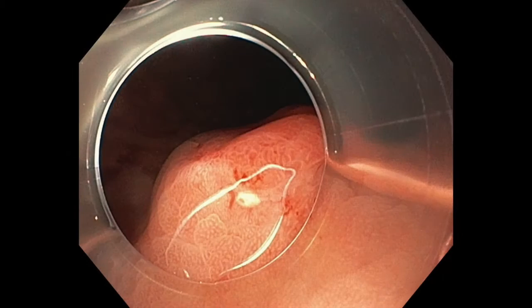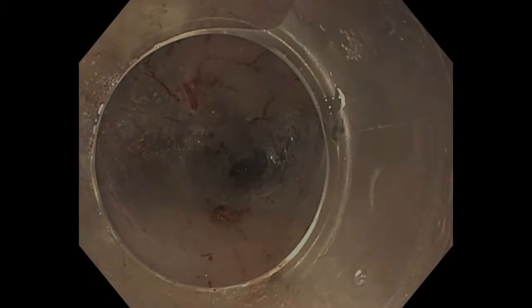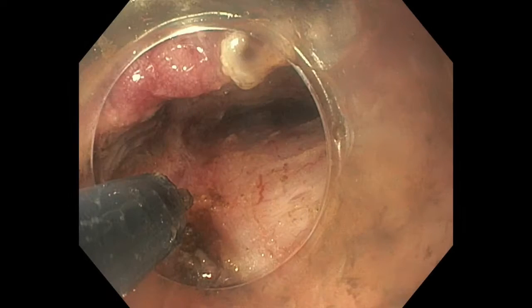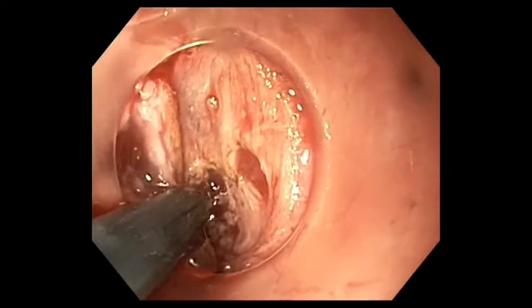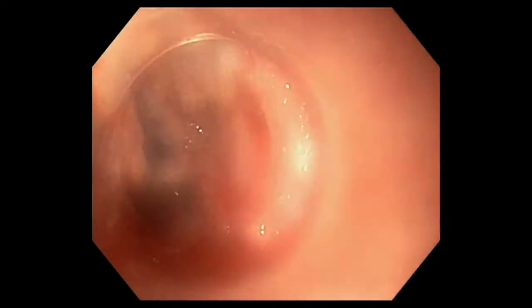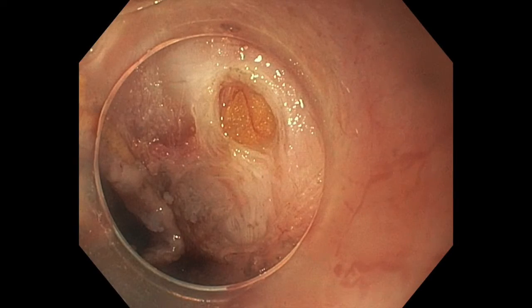This video demonstrates the resection of a gastric carcinoid tumor with the pocket creation method. The main purpose of this production is to present the management of adverse events that may be encountered during a gastric ESD, such as bleeding and small wall defects.